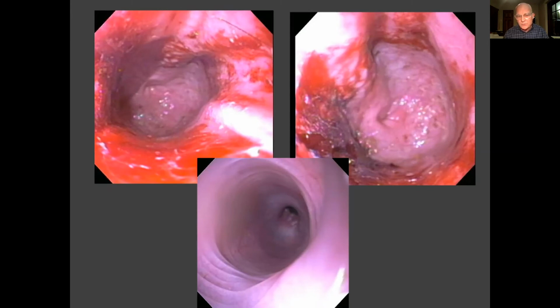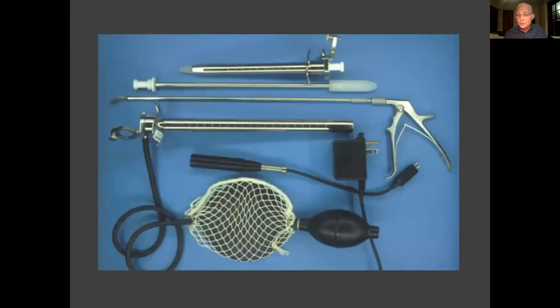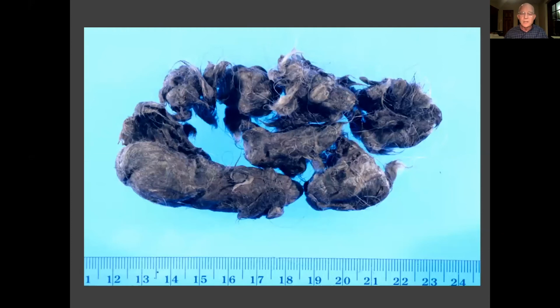Now the hairballs really form in the stomach, and then the cats vomit, and that's when they lodge in the esophagus. So another approach, if you're biting off and just getting very small pieces, is to use a rigid instrument and pass a forceps through it, as Dave sort of described earlier. Then you can take multiple pieces, and you don't have to keep taking a scope in and out, where you might cause more and more trauma to the esophagus, the pharynx, etc. So in this particular case, I did that. I don't have pictures of the procedure, but here's the final product of taking out multiple pieces of that hairball.